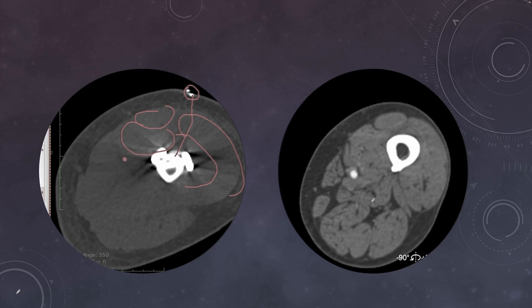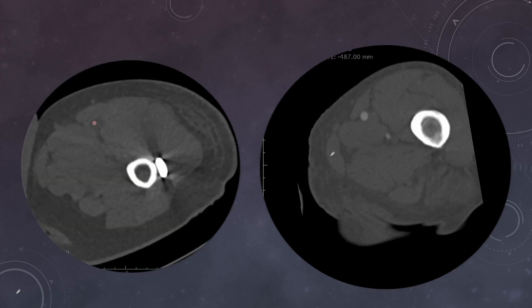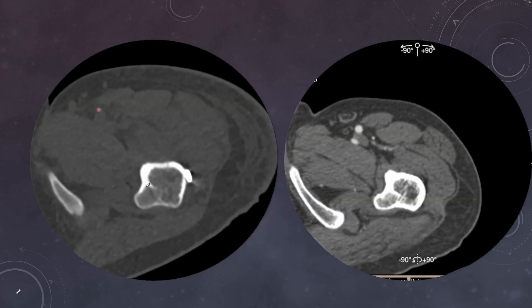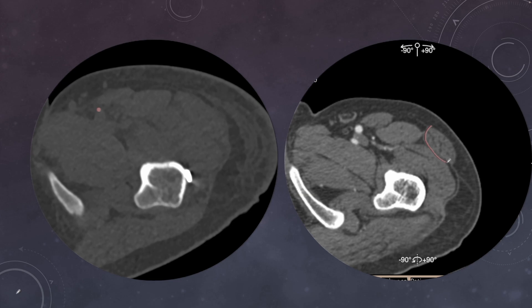Here also the vessel flare is quite clear on the medial side — it is under the sartorius — and the muscle bulk is covering the femur. This is rectus femoris, vastus medialis, vastus lateralis, and vastus intermedius. As we go more proximally, the vessel becomes more anterior and medial, again under the cover of sartorius muscle. Here the medial plate has ended and we are seeing only the lateral plate, meaning we are in the proximal subtrochanteric region of the femur. More proximally you can see the lesser trochanter and ischial tuberosity, and the vessel is quite anterior in the femoral triangle — again clear of the femoral diaphysis if we go from the anterolateral or directly anterior approach.